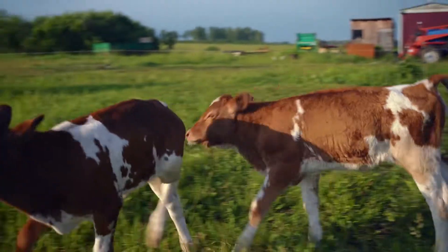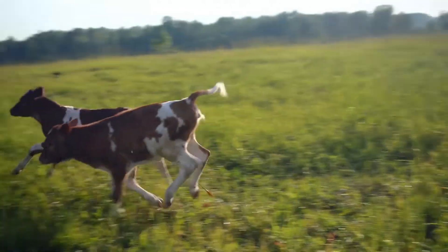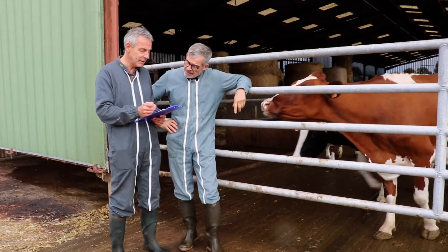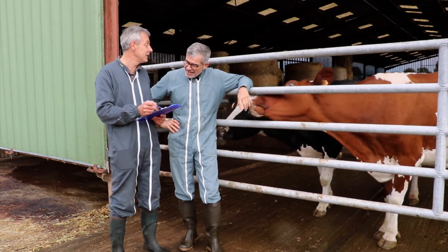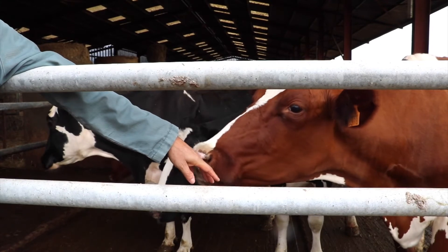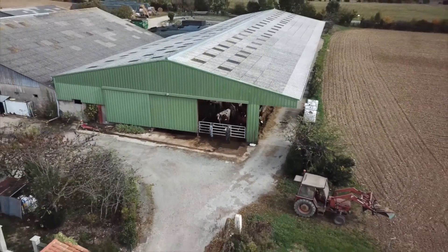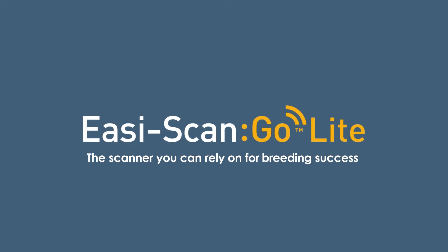Having the tools to create new life in tough conditions is one of the job's most rewarding experiences. The EasyScan GoLite gives you both the confidence, durability, and image quality you need to create new life. It's the scanner you can rely on for breeding success.